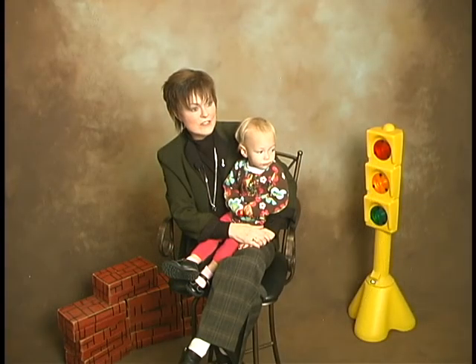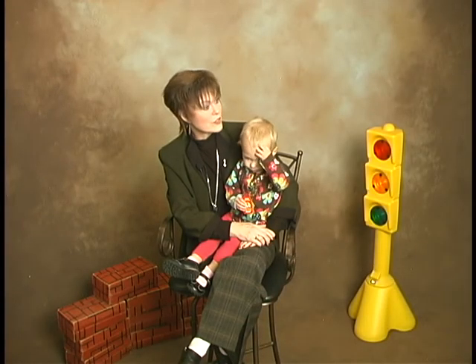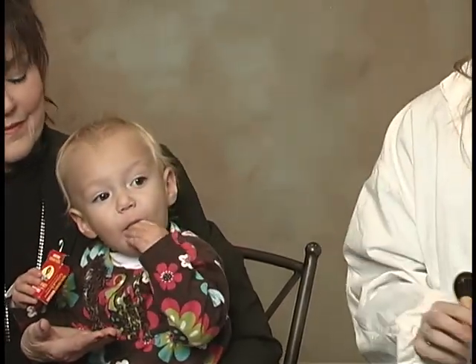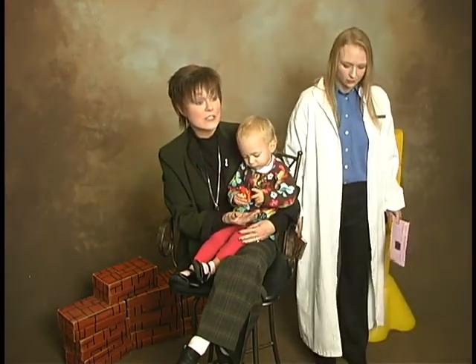Did you see the reaction when Dr. Rose first presented the sound of the tripod? Sentry's first reaction was to turn her head toward that sound. That's a normal reaction for an 18-month-old child. The one thing you want to do is make sure the toddler's attention is distracted so that you can present the sounds without them knowing it exists.